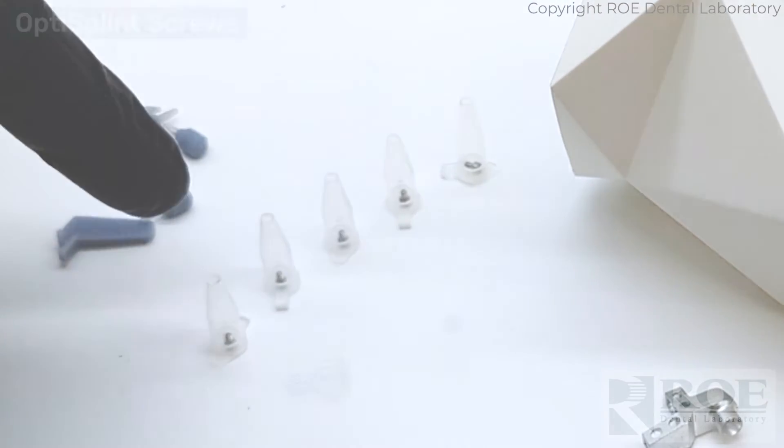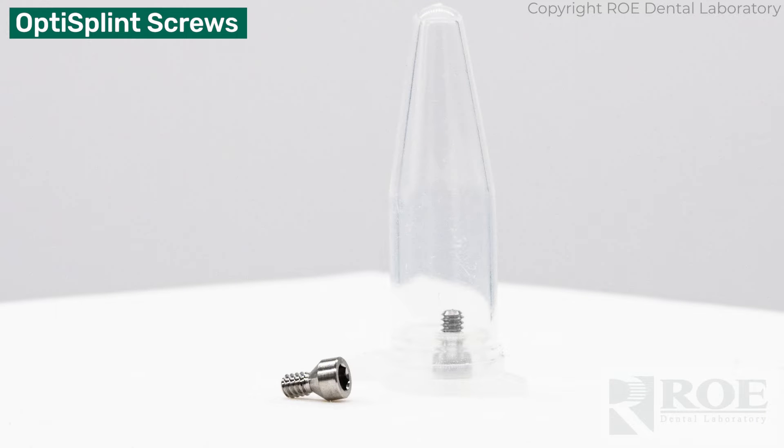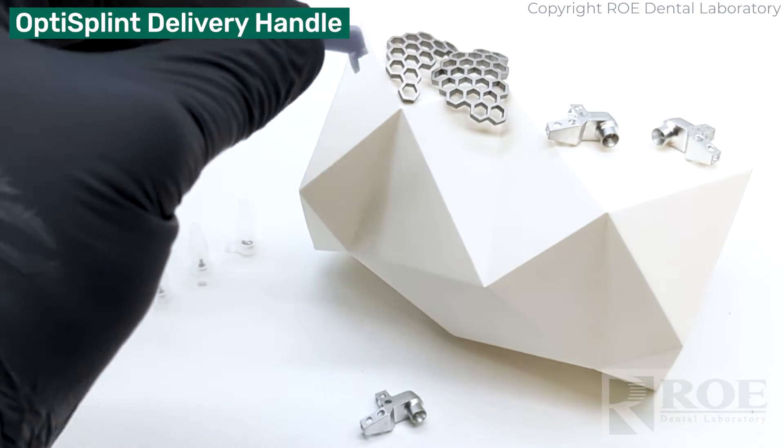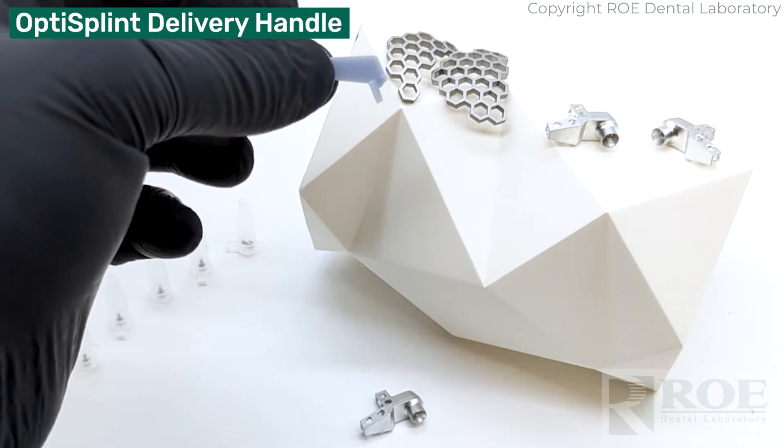You also receive screws for each of the OptiSplints, as well as a handle or delivery device for the frames.